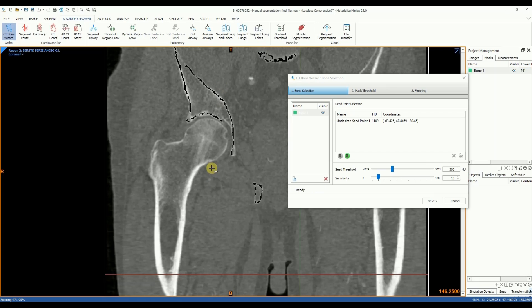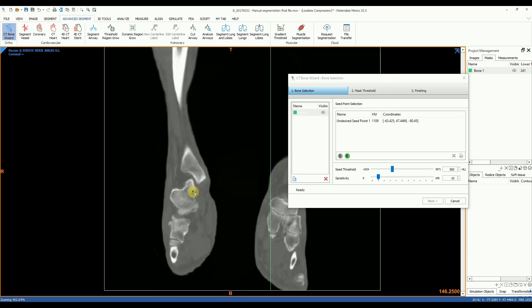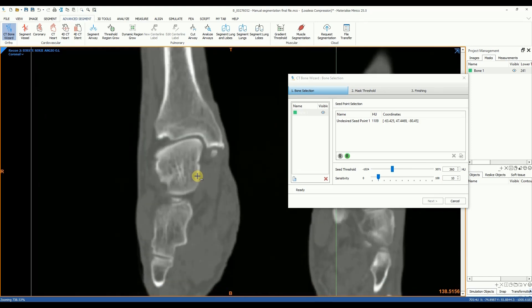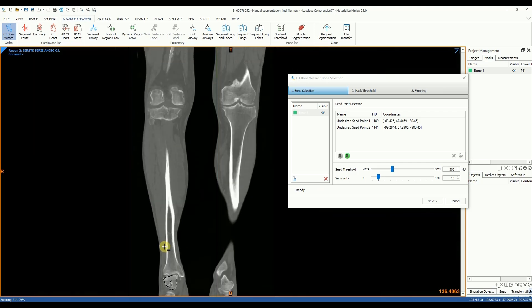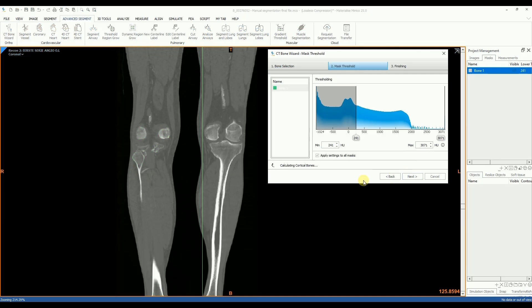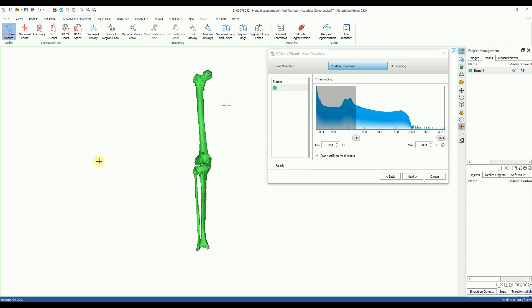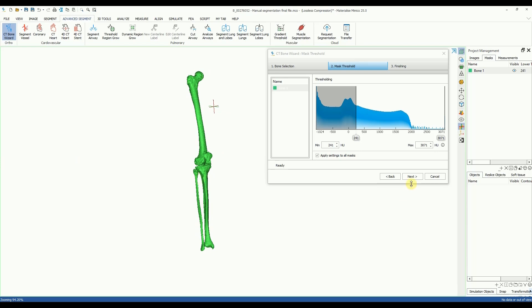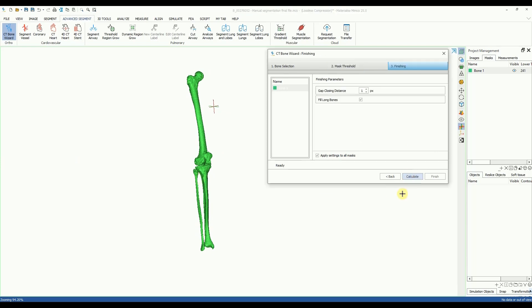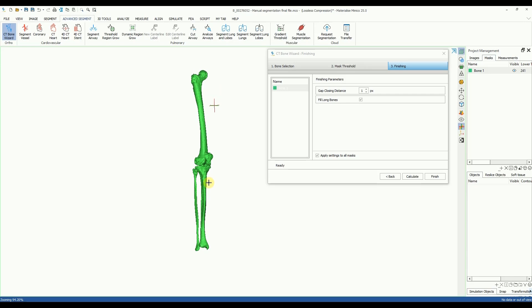We're still interested in the same anatomy, so again I indicate the femur, patella, tibia and fibula, but I'm also going to include seed points for the hip and parts of the foot that I don't want in my final segmentation. Afterwards I can adjust the thresholds of my region of interest and, as with the first example, I can preview these results directly in 3D. After clicking next I can choose to fill my final mask to end up with solid bones, as you can see right here in the 3D viewport. Unlike the method used earlier I don't have to perform this filling myself, and after just a few clicks this is what the final result looks like.